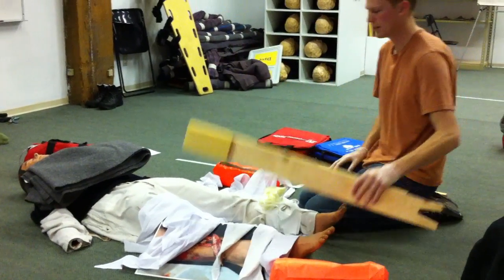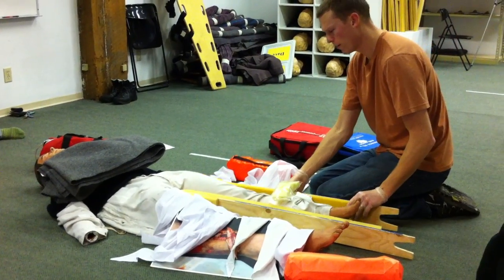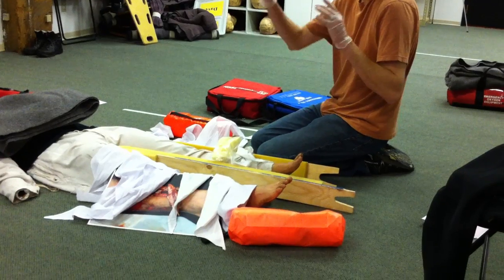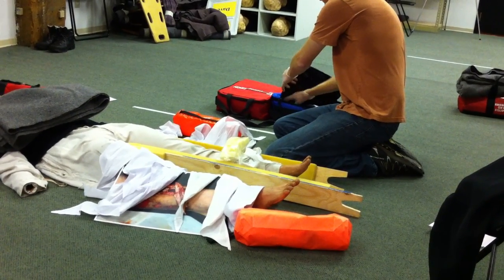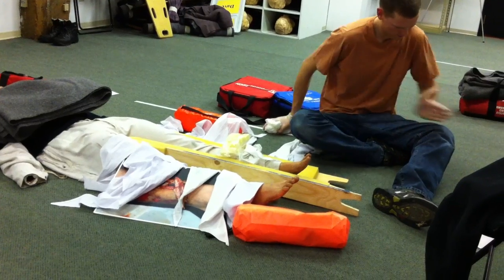And then we place these guys in here, and this one over here. Now, if we have that slight angulation to the limb, so it's nothing excessive, it's still going to fit in splints or on the board, we would be taking packing, okay, and let's say that the limb bent kind of like this, okay?